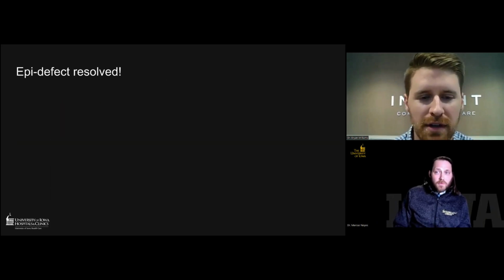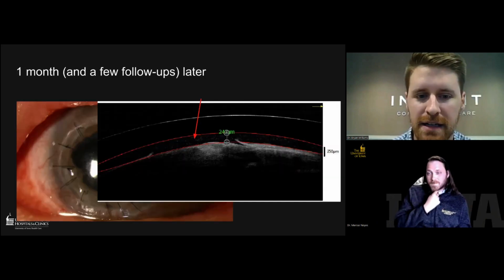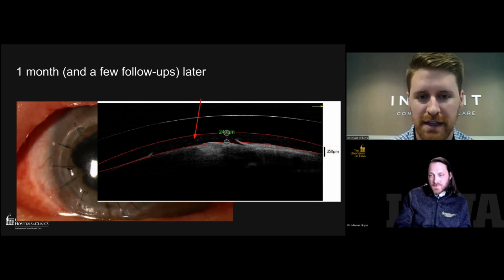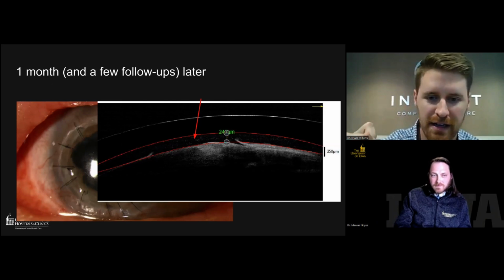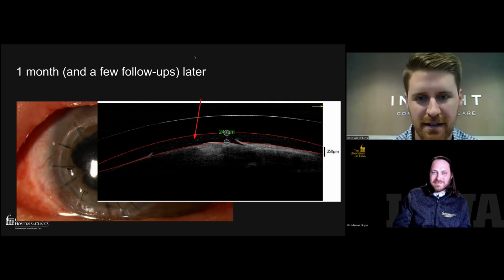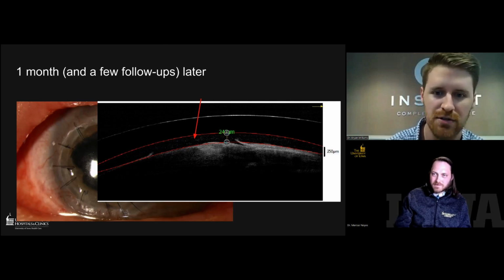That's a good point there, Marcus, that almost goes back to my initial dispense talk that we had previously too. Getting patient expectations for these, whenever sometimes they think they're coming to you with an immediate answer. Obviously, this is the most complicated of complex, but having them know that these lenses aren't designed just to correct their vision.